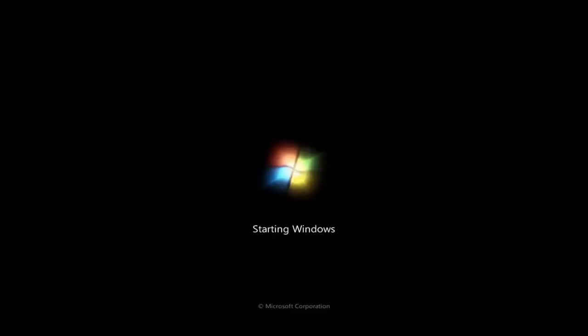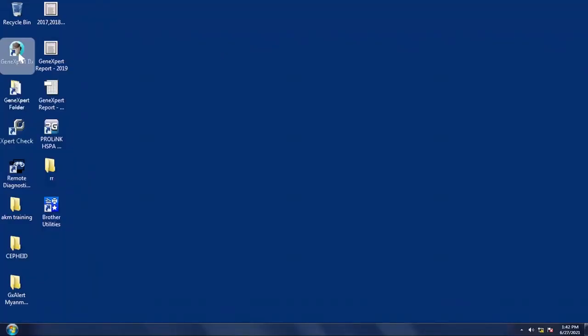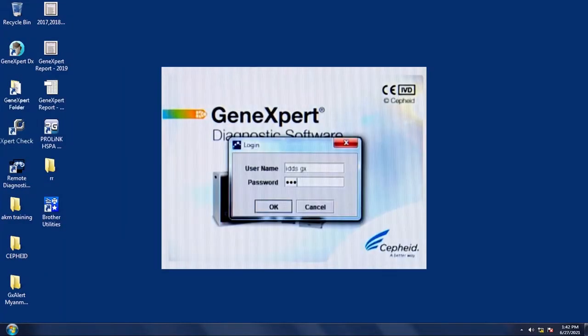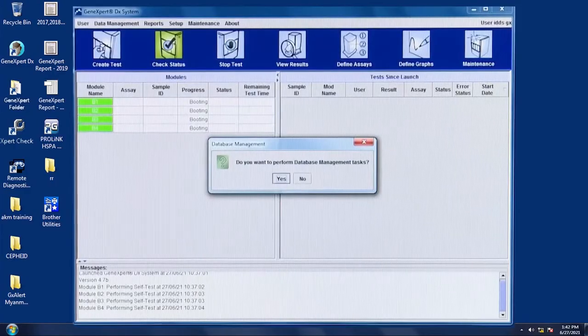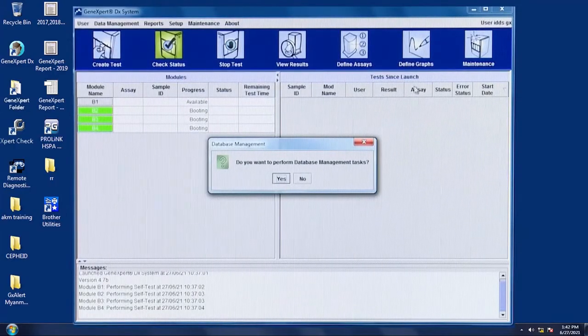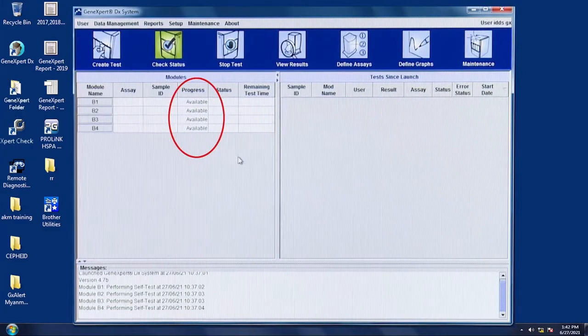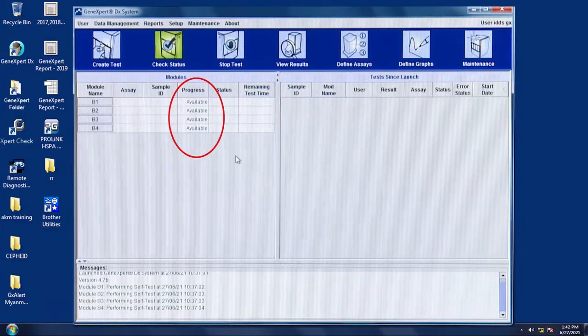After that, open the GeneXpert computer. As the GeneXpert DX software opens on your computer, log in using the username and password. Click No if Database Management dialog box appears on the GeneXpert DX system computer software.